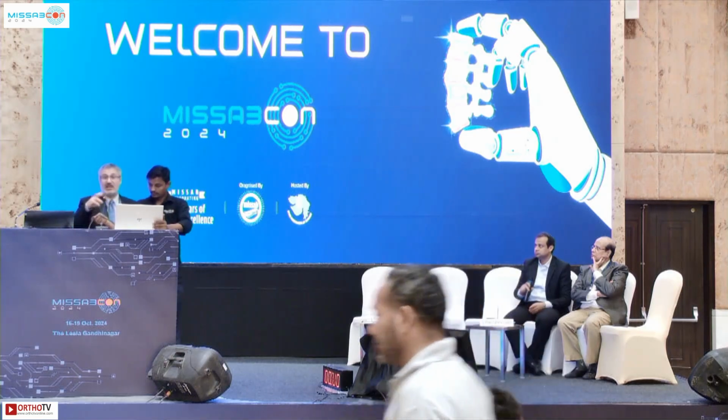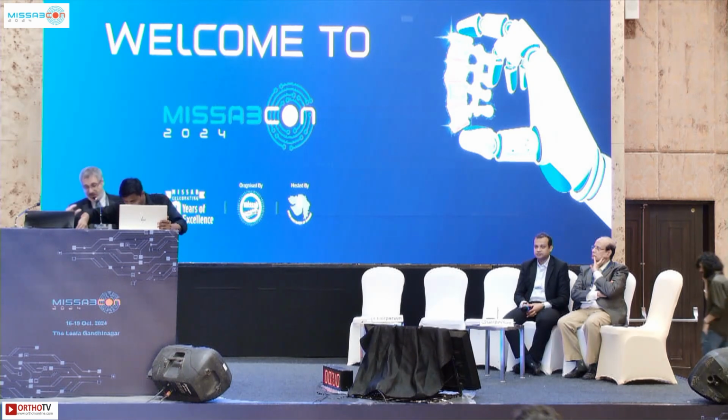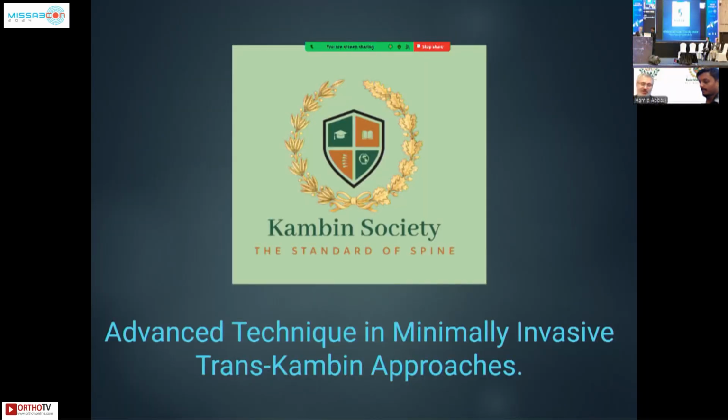Obviously we were talking about OLIF ATP, which, practically like ALIF, has a huge cage, and the significant correction of lordosis is very representative. I'm happy to hear that your number, about 2.8 degrees, is very representative of my experience so far, 2 to 3 degrees. And certainly with a smaller cage, the correction will be limited as well.